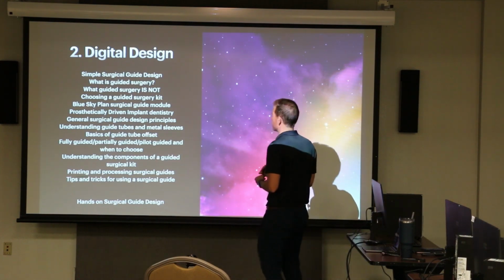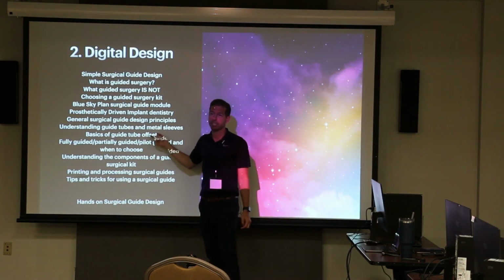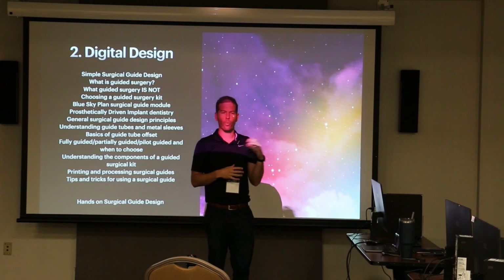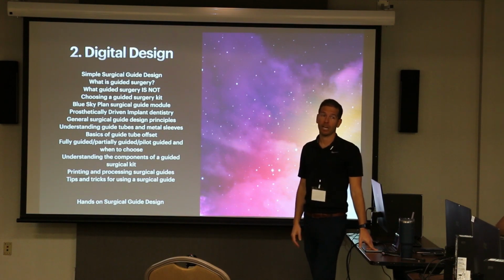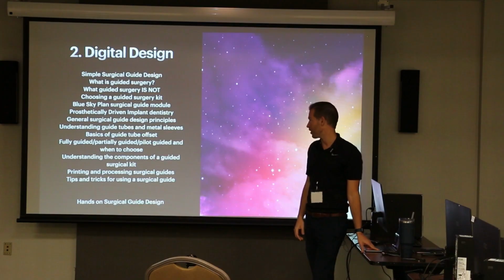The big thing is really learning some of this terminology called offset. This is probably the biggest question that I get: how do you change the offset from the implant body to the top of the guide tube, and why and when? We're going to touch on that a little bit today, but we don't have quite the time to go in depth. But that's a concept you have to nail, because that's probably the biggest question. How do I remove teeth off a model, and how do I change the offset of the guide tube? You have to know that stuff.